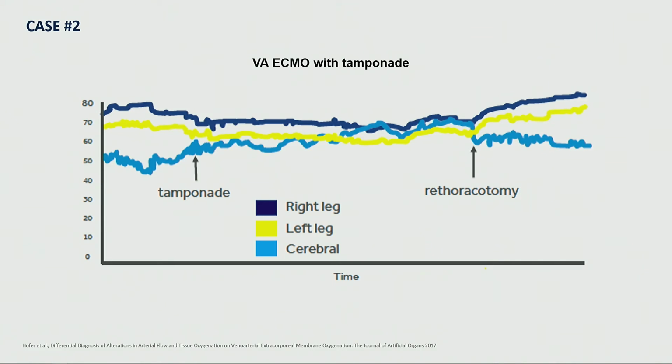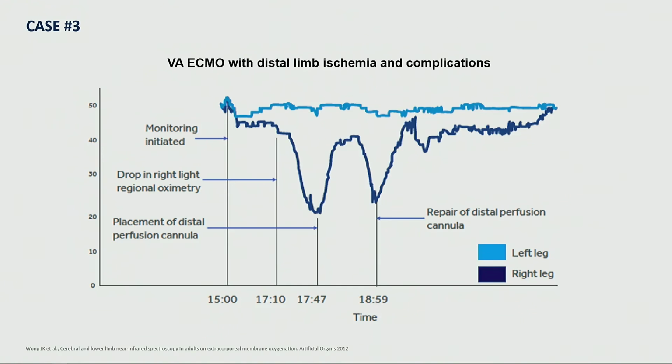And if you look at the case report, they obviously did a TEE, and then they went ahead and performed a re-thoracotomy and rescued this patient. So fairly interesting example right here.